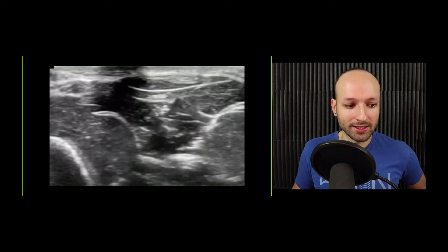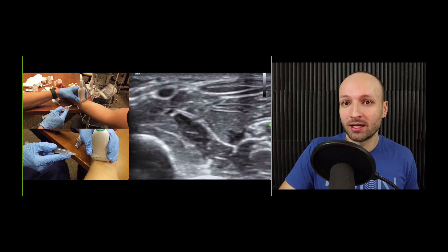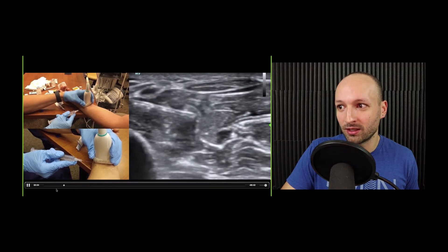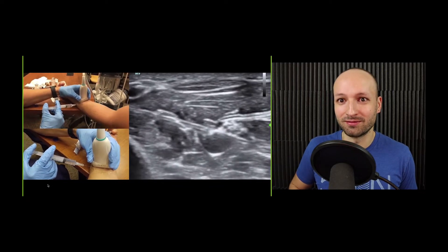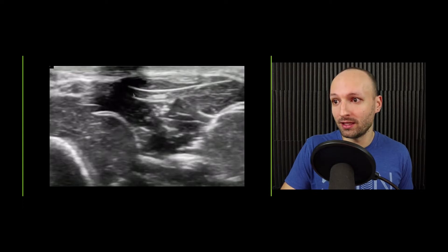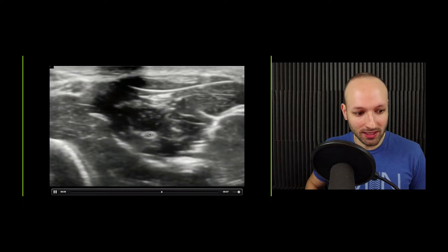What I usually do instead of the long axis is the short axis — there are one or two nerve blocks I do in the short axis. The reason is that when you come at it laterally, you're going through a lot more tissue. When Matt went through that tendon in the long axis approach, that was the most painful part — out of all the blocks he did, this one hurt the most because of going through a tendon. What I prefer is a short axis technique: I come at it basically like I'm doing an ultrasound-guided IV, track it down, and here you can see my needle right next to the nerve doing hydrodissection to get fluid around that median nerve — a little donut around it.